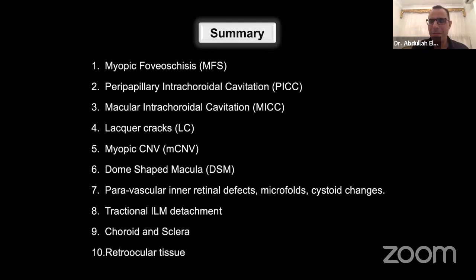Yeah, thank you. That's a really important question. I do OCTA for almost all patients, highly myopic eyes, especially if I suspect any presence of CNV or the patient coming with a blurring of vision. In most cases, you can pick up the vascular network, at least a part of it. Sometimes you can also look for the flow. But as you know, there's many segmentation errors within the OCT angiography.